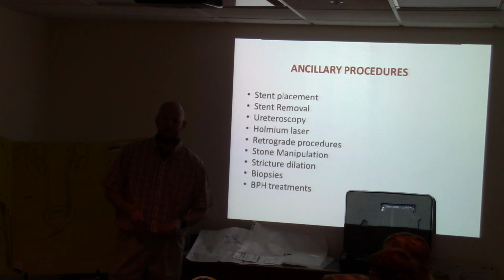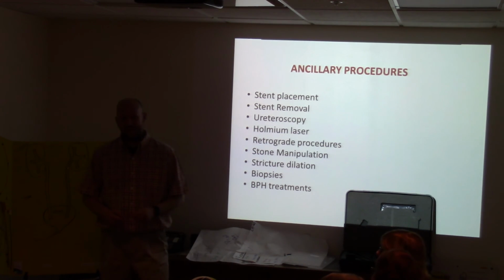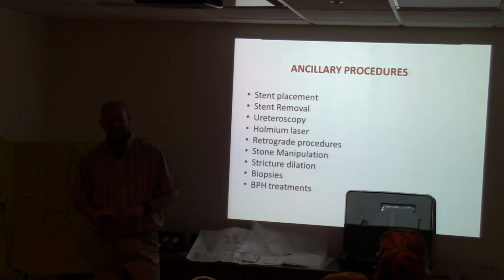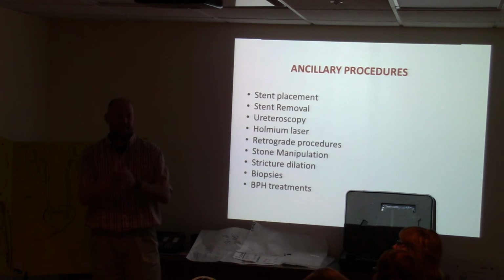Okay. So they don't need to do anything, you just kind of look away. And then you can see, because they inject contrast, and the body's filling with contrast instead of it staying in the collecting system.